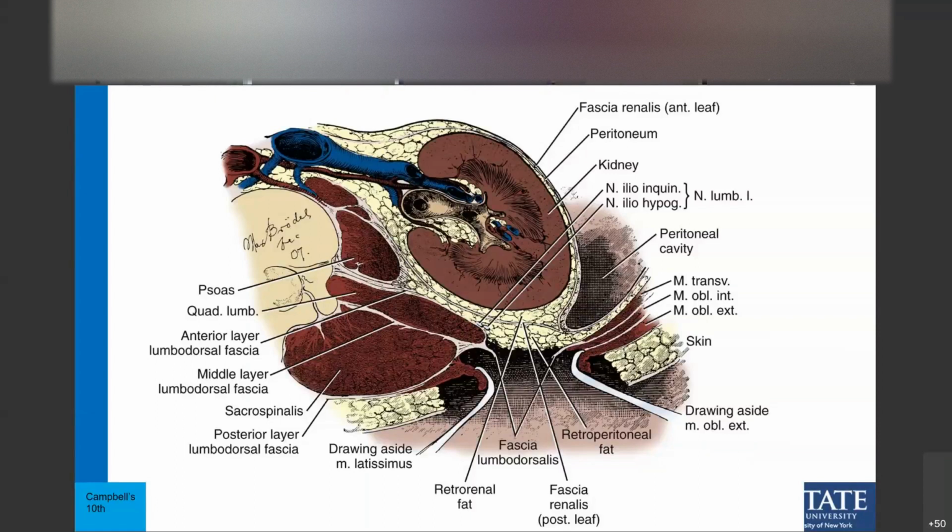So what ends up happening is if you want to hit that posterior calyx, you're not going to have any problems as long as you can see it. And you'll have a nice access where you can get into the whole pelvis, down the ureter if you need. But if you go towards an anterior calyx, what will happen is you'll go right through those interlobar arteries, and you can get a lot of bleeding.